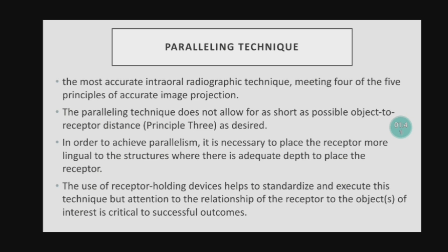First, the paralleling technique. It is the most accurate intraoral radiographic technique, meeting 4 of the 5 principles of accurate image projection. The paralleling technique does not allow for a short as possible object to receptor distance, which is principle 3, as desired.